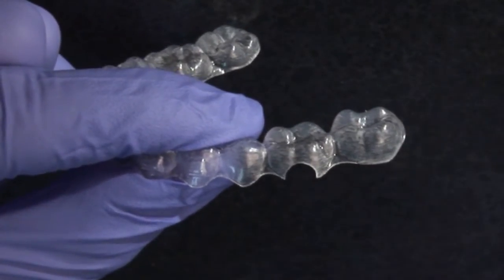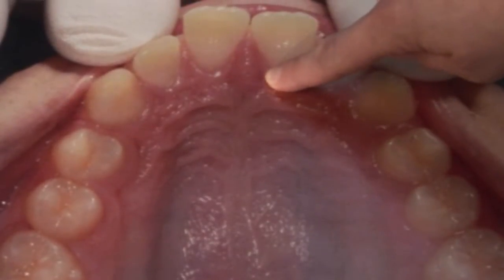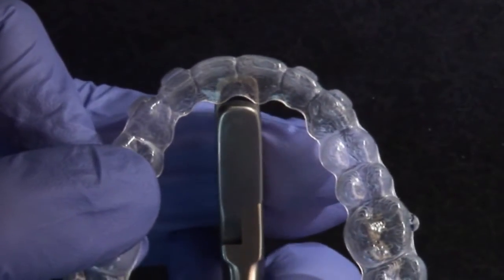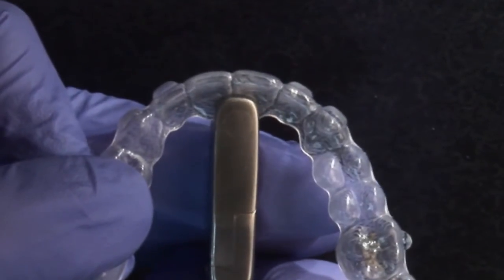These half-circle cuts permit the addition of bonded buttons or hooks, or are simply used to relieve impingement of the plastic of an aligner away from soft tissue. The half-moon cutouts can be placed on any tooth, buccal or lingual, where bonded buttons, elastic hooks, or even orthodontic brackets are needed.